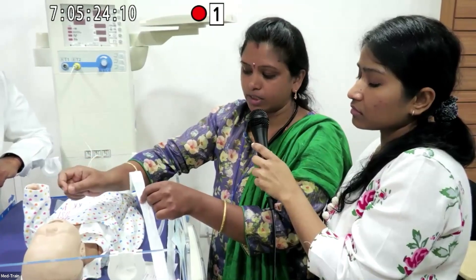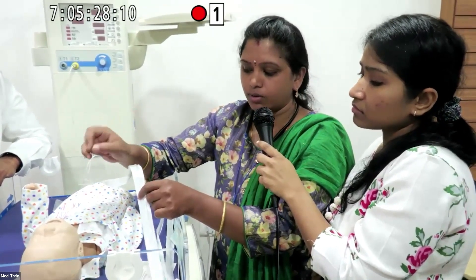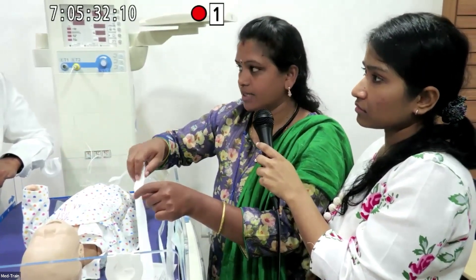When removing the suction catheter, it has to be withdrawn in a rotatory manner. Suctioning should not exceed 15 seconds — keep each suction pass under 15 seconds.